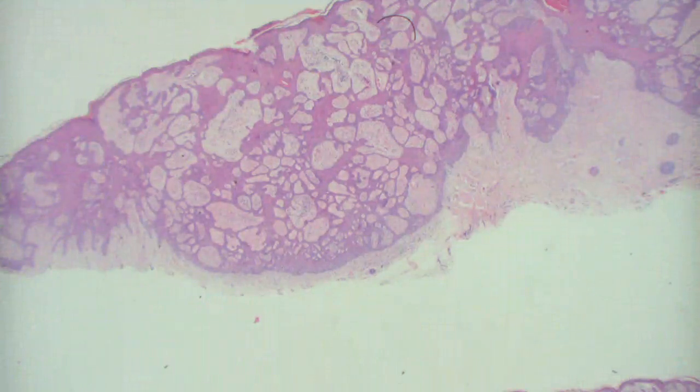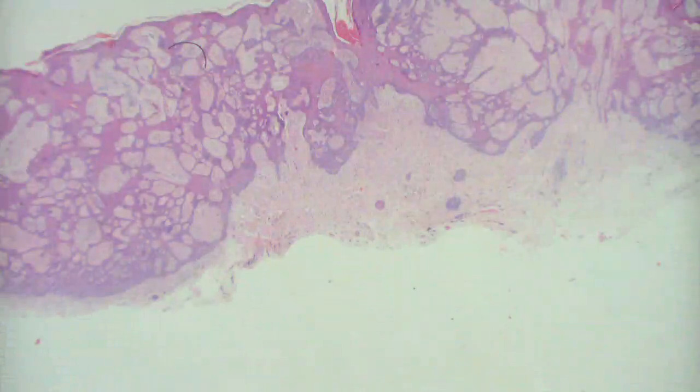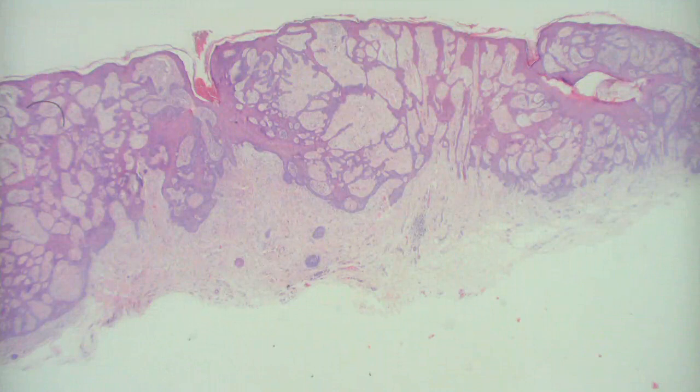Yeah, it extends a little bit more deeply. Usually TFI is around this area. So when they get these large nodular reticulated aggregations that go down deep, and they get more basaloid areas, some of that favors Pincus. Some people think these are analogous to basal cells. They usually get re-excised, but I think they behave in a very indolent fashion. They usually come as skin-colored papules, usually on the back. They don't look cancerous. They get biopsied and diagnosed, and people excise them.